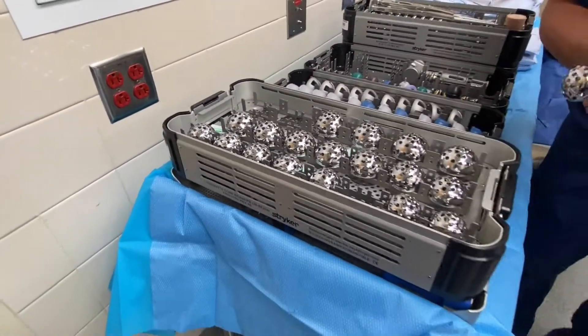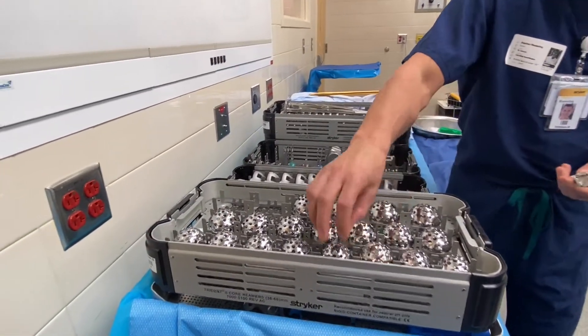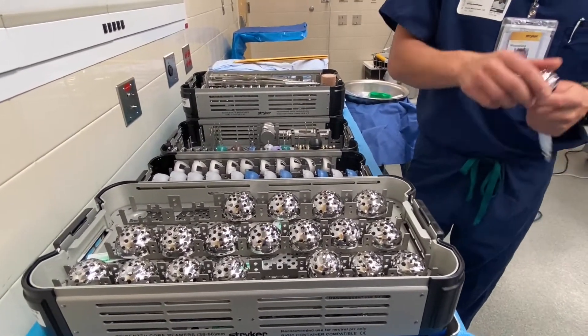There are two reamers. I can either just bring the reamer out, hold it, and you can change the top — that's what I normally do — I just pull it out, hold it, you can change it, or I hand it back to you. Then I trial.